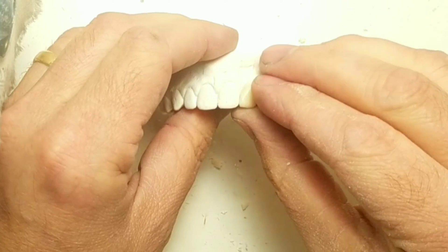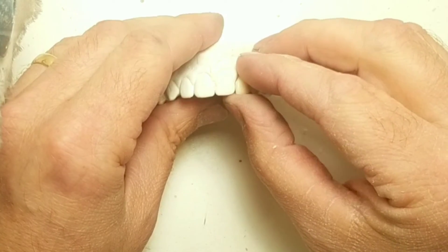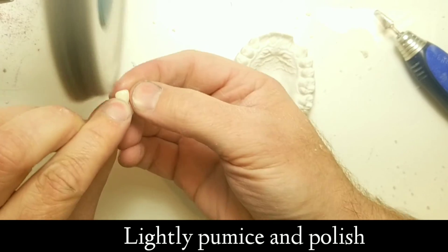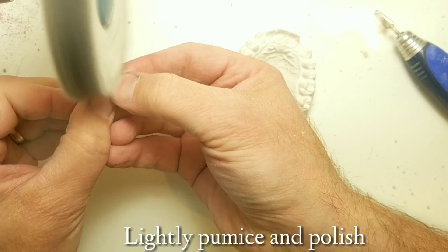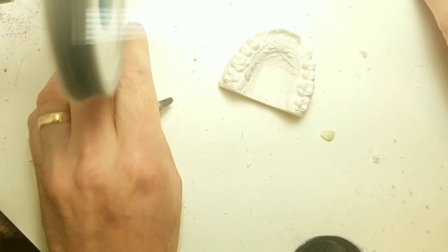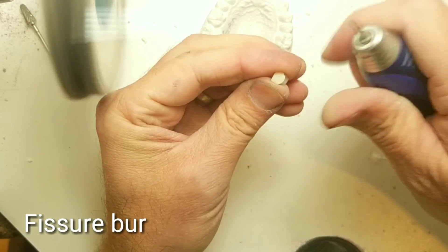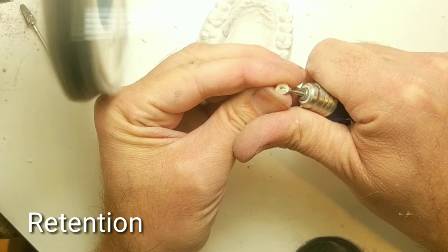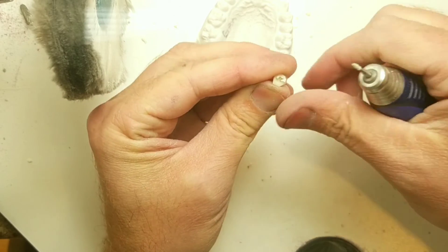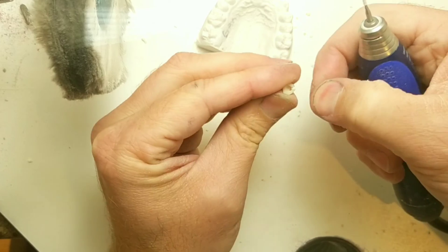This is probably the hardest part — setting teeth to make it look natural. I'm going to shine it up just a bit. Then I create a divot where the Invisicryl will suck down on it, or where your invisible retainer will suck down on it.